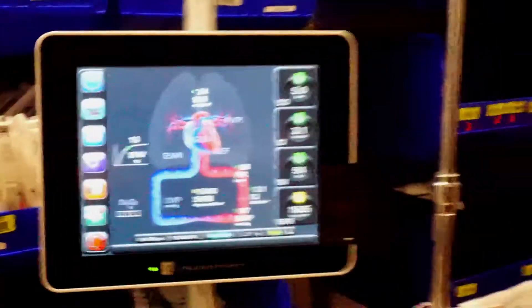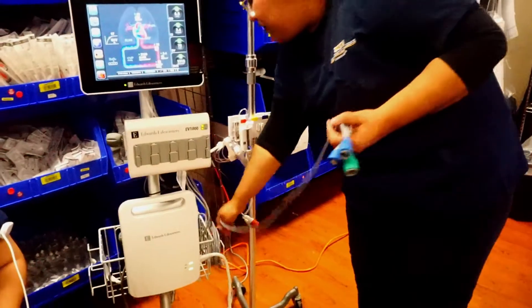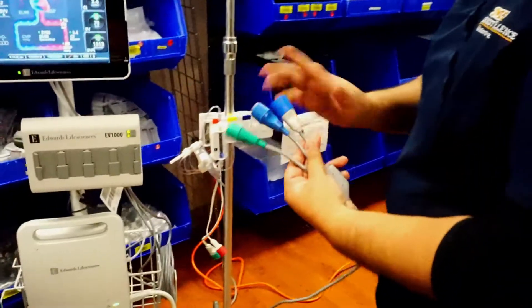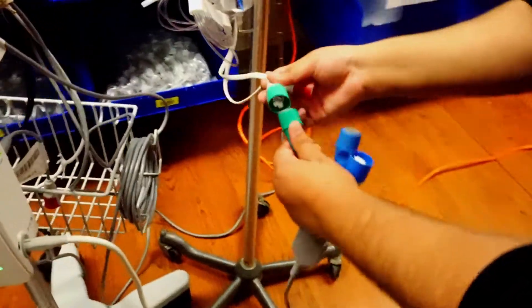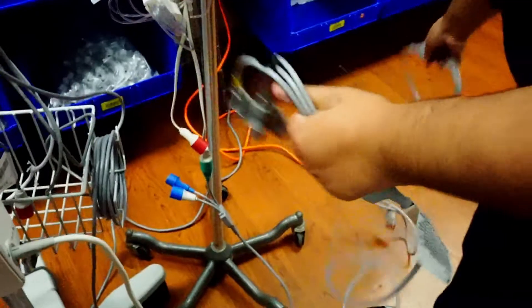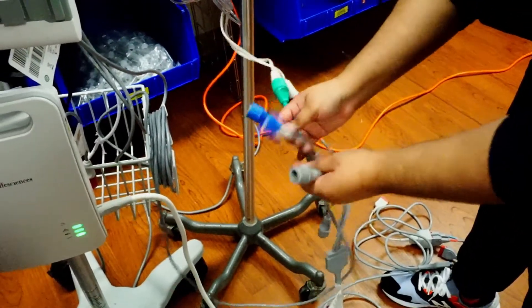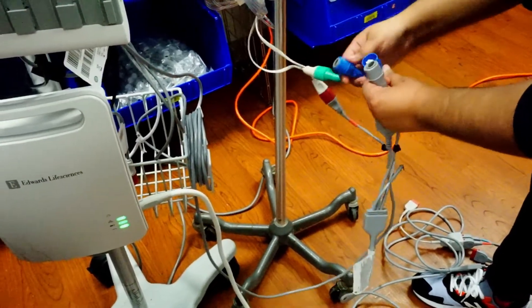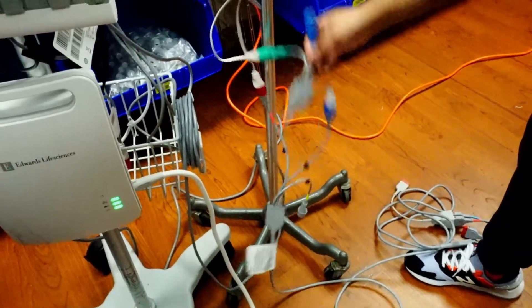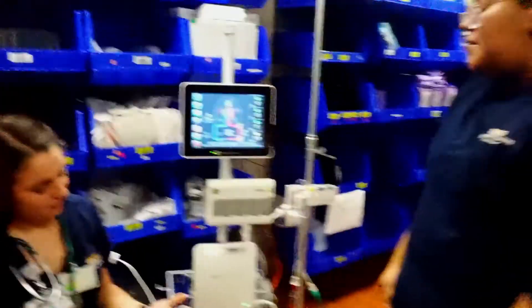If setting up invasively, grab the gray cord, go to your A-line setup, and plug green to green. The red plugs into the monitor cord. If you have CVP set up, connect that end as well. Your main monitor will still receive your A-line and CVP, but this machine is also connected and will be able to sense those numbers too. That is how you set up your EV1000 invasively.